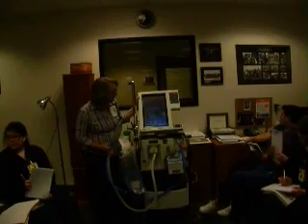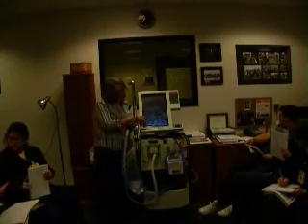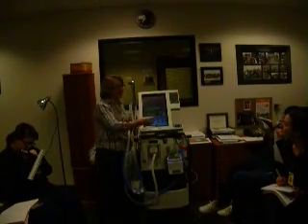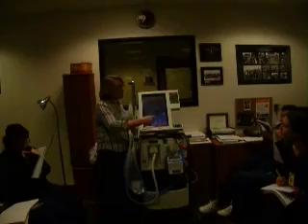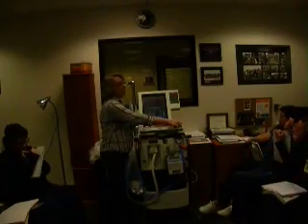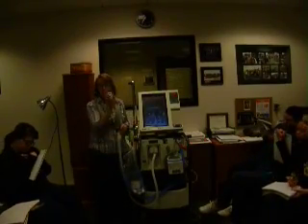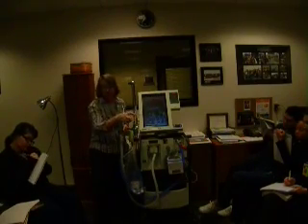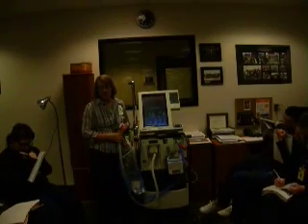Yeah, that'll help. Okay, so then we have minute ventilation. The other thing, you guys, to the number to the left, you'll see there's numbers here. The number to the left tells you what your patient is averaging, so that you can use that as a guide to where you need to set your parameters, which is actually on the right. So everything on the Puritan Bennett is you touch it, it turns orange, and you turn the dial, and then you hit accept to confirm it. If you don't hit accept, it's like not doing anything at all. So touch the button, it turns orange, turn the dial to make your change, hit accept to confirm it. If you don't hit accept, it goes back to where it was and your change was never made.